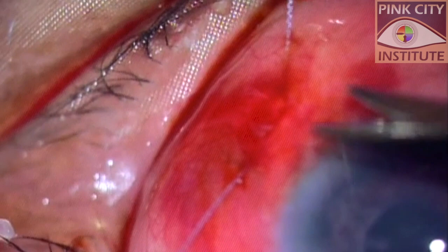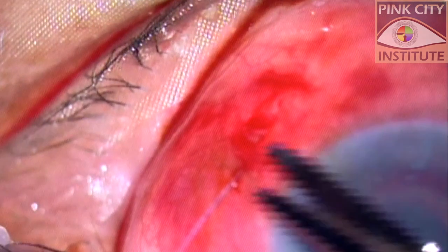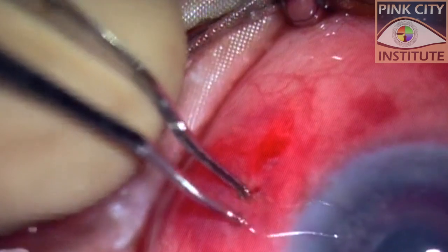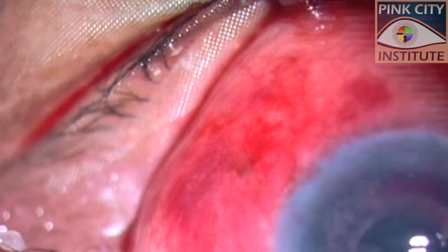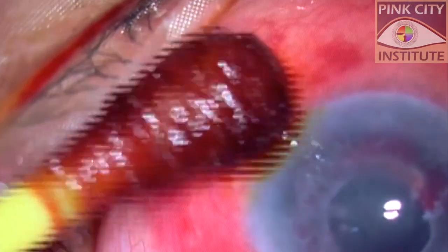Instead of tying the two ends of the suture, they were trimmed flush with the conjunctiva. The conjunctiva was gently displaced to let the cut ends of the suture slip into the subconjunctival space, ensuring that none of the Vicryl remained on the surface. A negative Seidel's test confirmed secured closure.